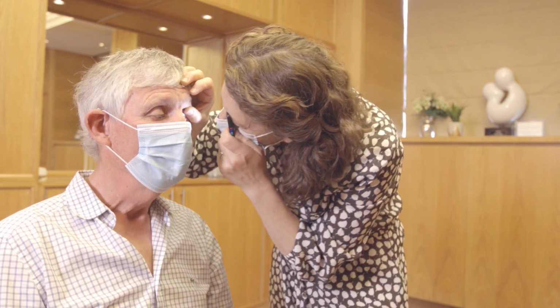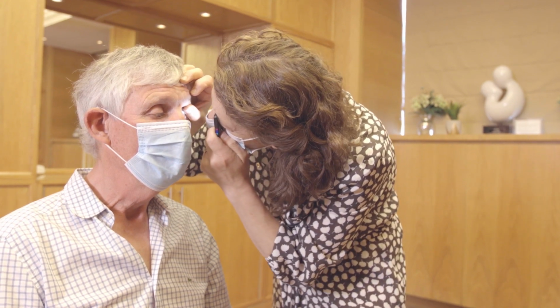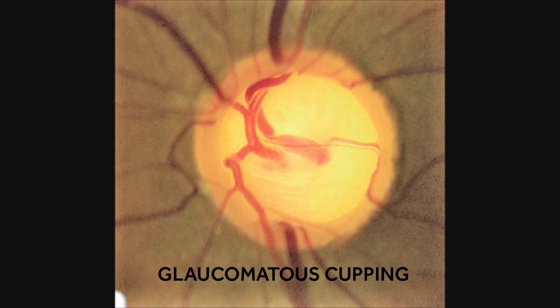The discs will come into view almost immediately. If not, retinal vessels can be followed back to the disc. The most important features to be observed about the disc are its colour, the clarity of the edges, and the disc cup ratio. Here are some pictures to illustrate the discs.